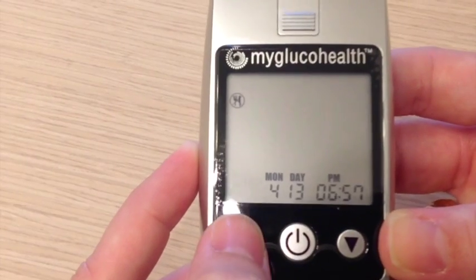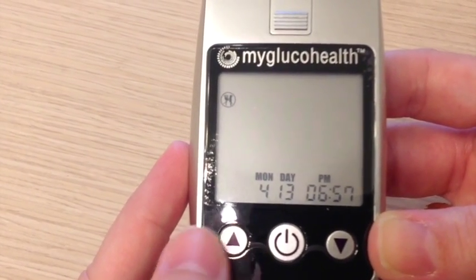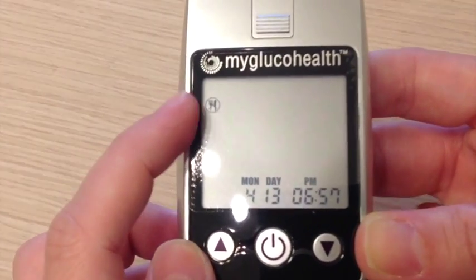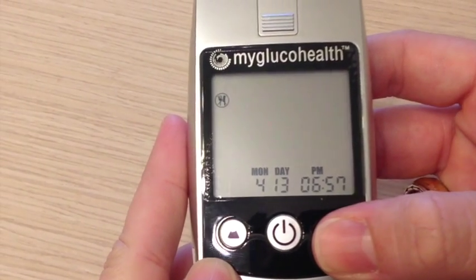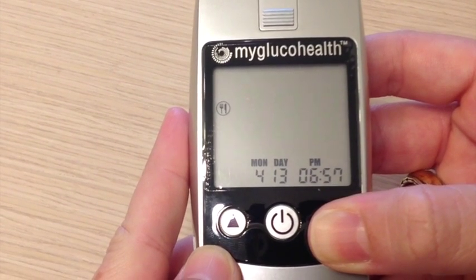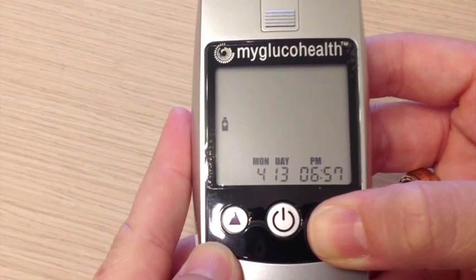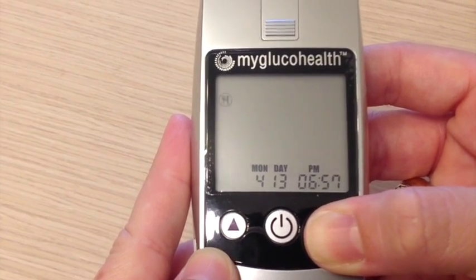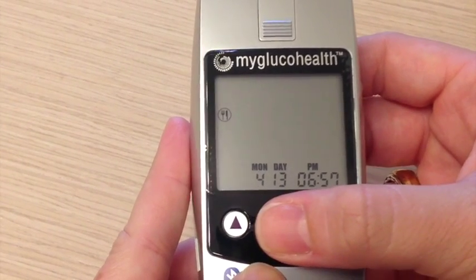It automatically will default to a fasting status, which is the symbol right here — a fork and a knife with a line through it. Use your up and down arrows to change the status. This is a fork and a knife without a line, so non-fasting. This is if you have taken medicine, and this is for exercise. We're going to choose non-fasting and press the button in the middle.